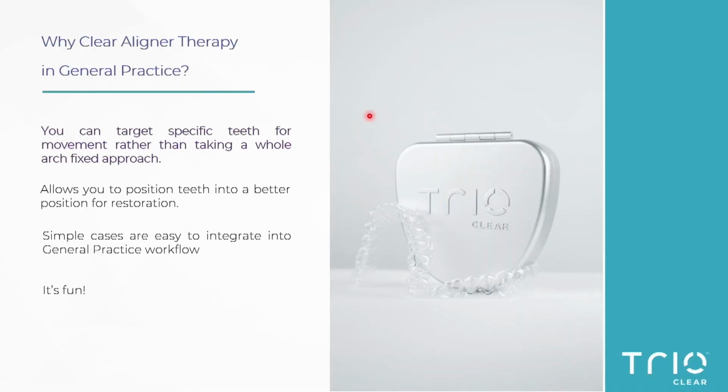Why clear aligner therapy in general practice? The big advantage in general practice is that we are able to target specific teeth for movement rather than taking a whole arch fixed approach, which is what you would traditionally take with fixed appliance therapy. In other words, every tooth that you put a bracket and a wire on in fixed appliance therapy will move. Whereas in clear aligner therapy, that's not necessarily always true.